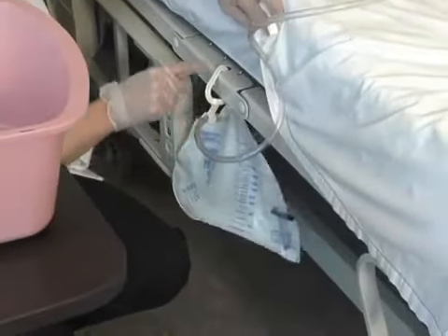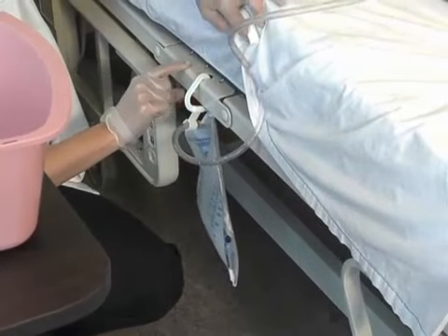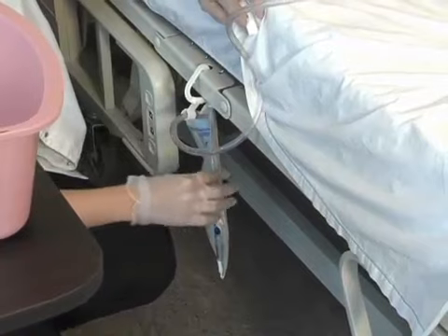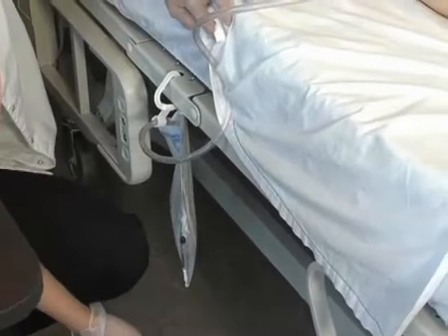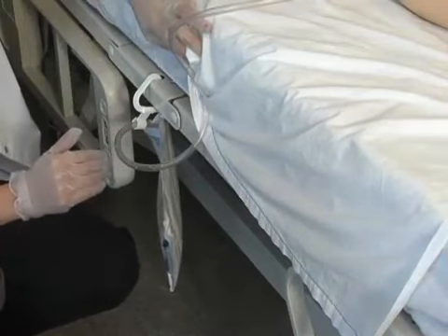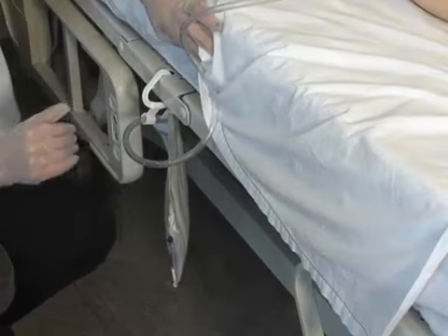It should be attached to the stable foundation on the bed, which means that this is a part of the bed that does not move, and that it's not touching the floor. So all those things you need to be careful about when you are verifying catheter placement.